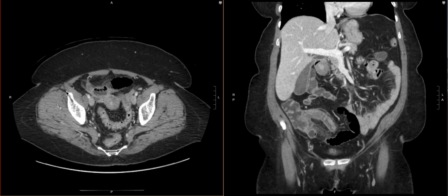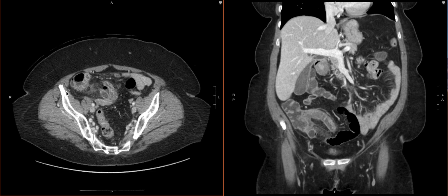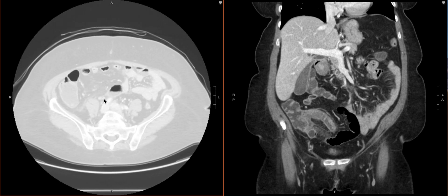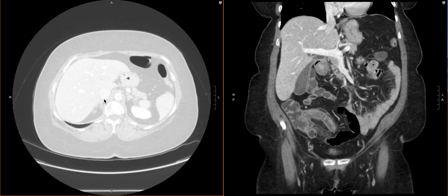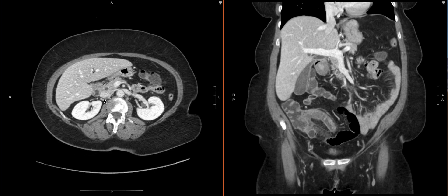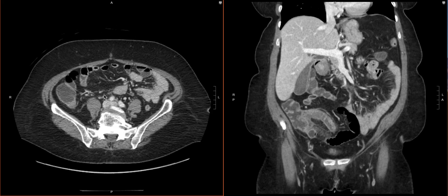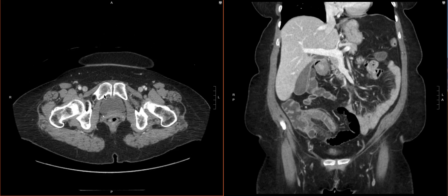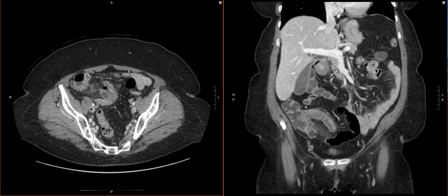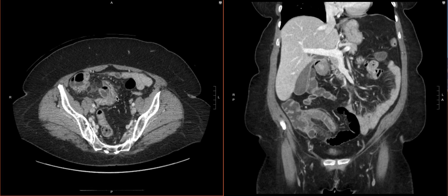When we're looking for evidence of perforation, it's always good to look next to it. We see a little free fluid, a little bit of free air. But what you can also do — and probably should do every time — is put on your lung window and look systematically throughout the abdomen as you're doing your search pattern. And then similarly with your soft tissue windows, look for free fluid and any fluid collections. It looks like this is pretty much the only one right here where we have a little fluid and air.